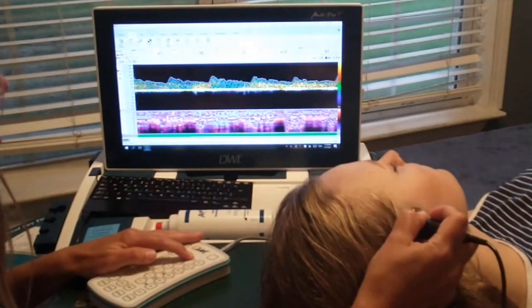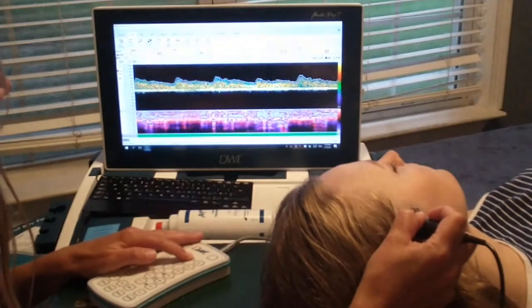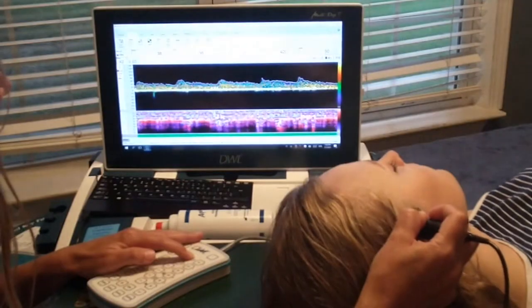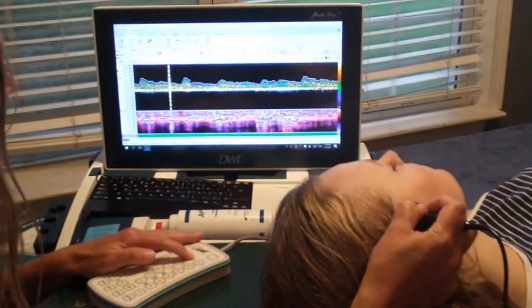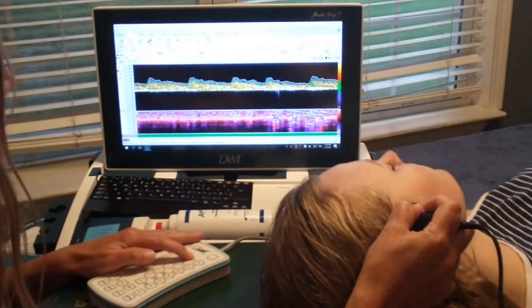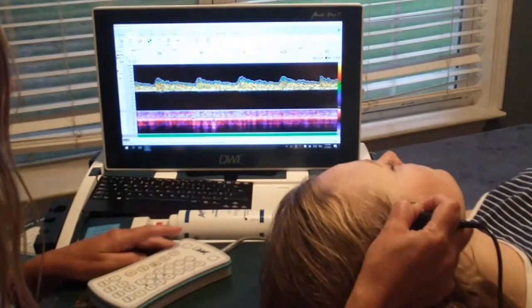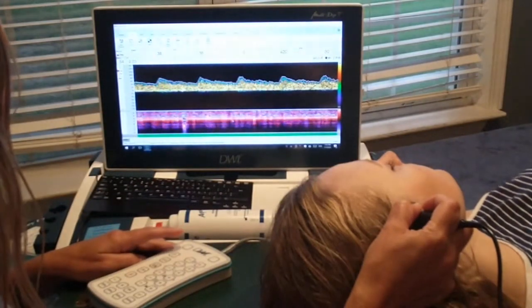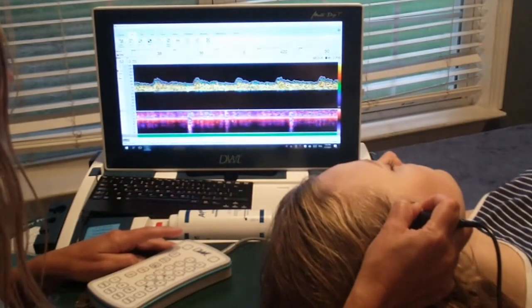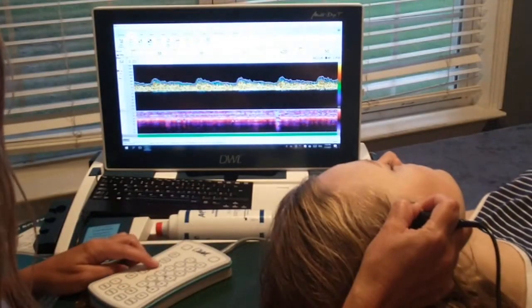I am constantly tweaking the probe and angling. And I can see in the M mode that this is the most superficial depth that I'm going to get an optimal signal on my MCA. So here I'm going to start my saves. To save, you're going to hit the floppy disk on the remote.